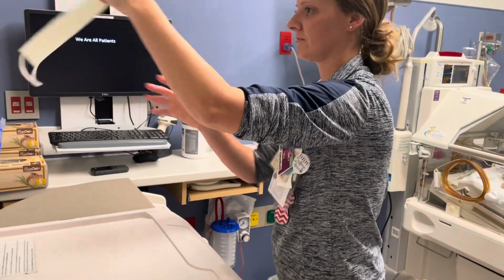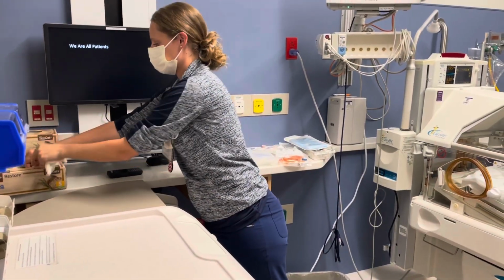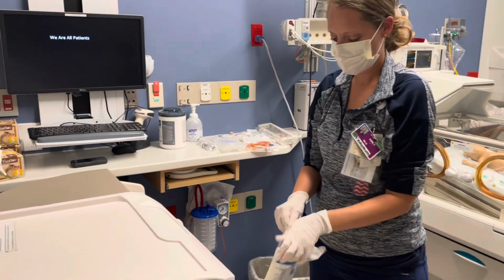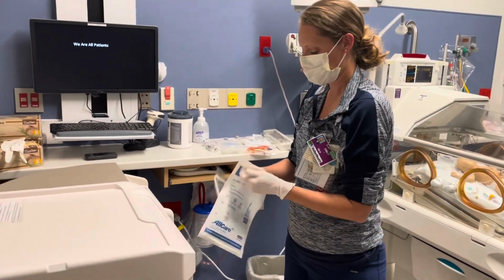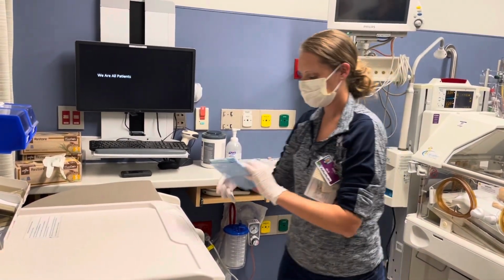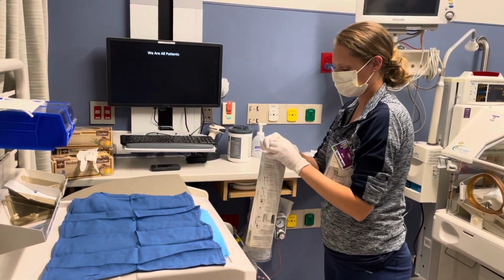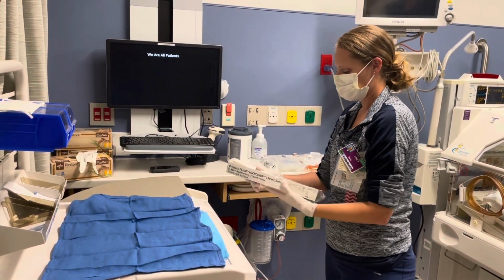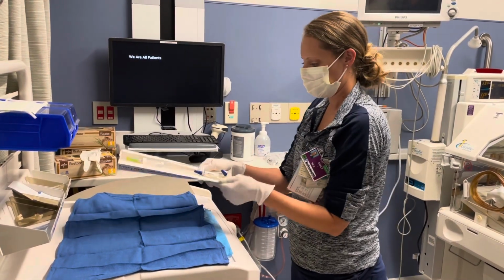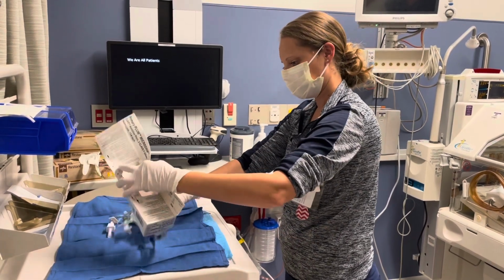Once cleaning is complete, Emily would change out her gloves, place a mask on, and begin to prepare her IV supplies. Among the supplies is a sterile towel. This towel is only used for barrier from the surface areas. All of the IV tubing has a sterile pathway, so it is key to maintain that sterility by not touching any of the exposed ports.